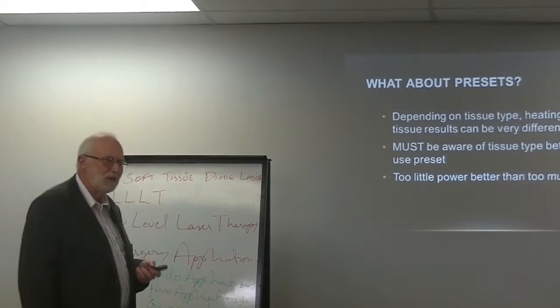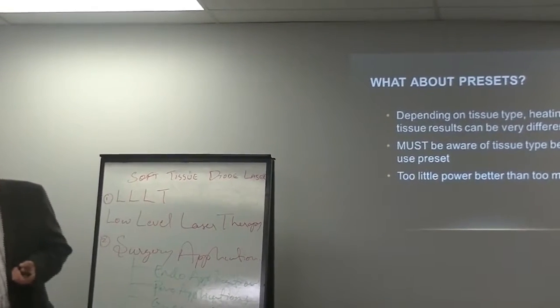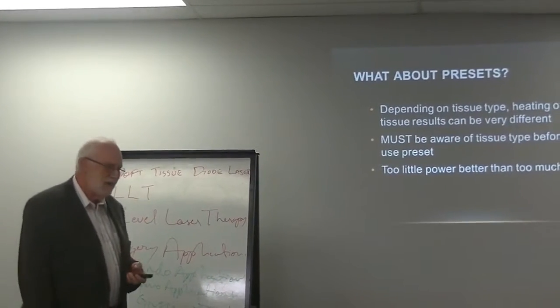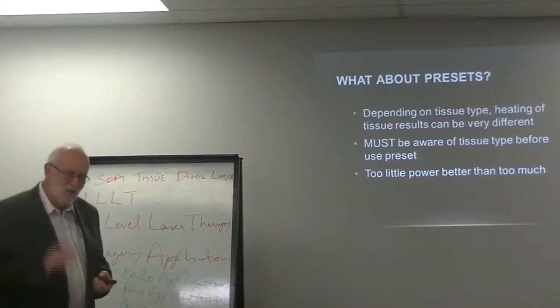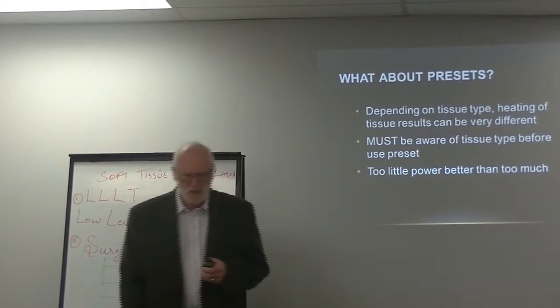Actually, probably never, because my laser doesn't have presets on it. With the original YAG, I set the power, I set the pulse rate, and that's what it is. When I picked up a diode, I've never used a preset on a diode. So I go to one setting and just move it from there. The only time we'll use presets is with low-level lasers, and I'll explain why later.